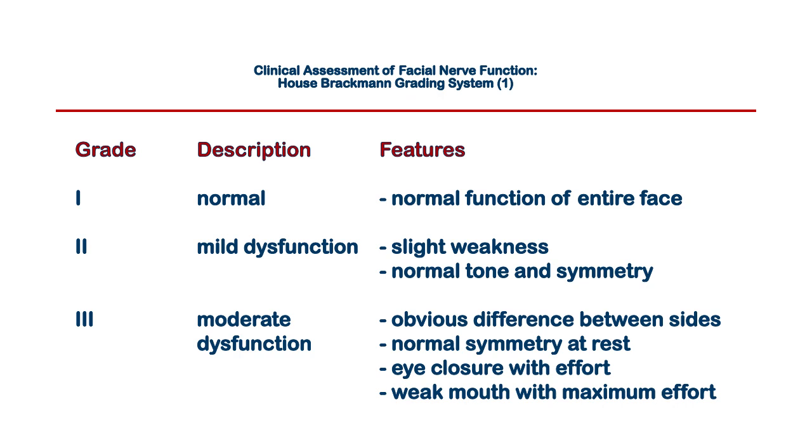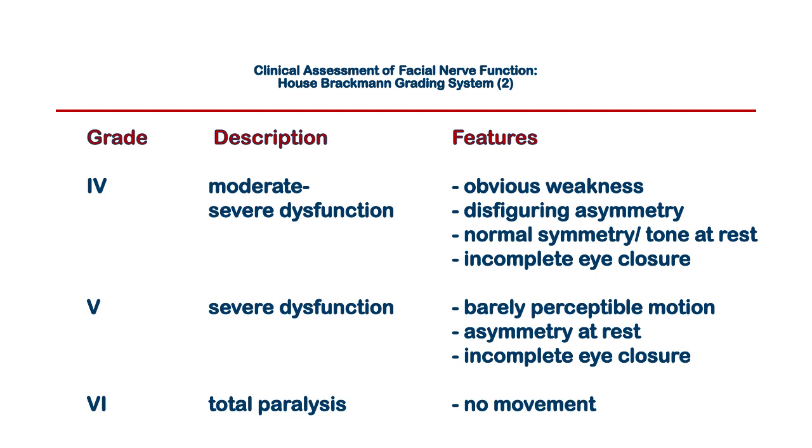Or if a patient came to a physician and said, I think one side of my face is a little weak, that would tip the physician off, and they'd probably put them through their paces, smiling and closing their eye, and begin to see that there was a problem. But ENoG is normal for 1, 2, and 3. No, the ENoG would be perfectly normal. Good, large facial nerve response.